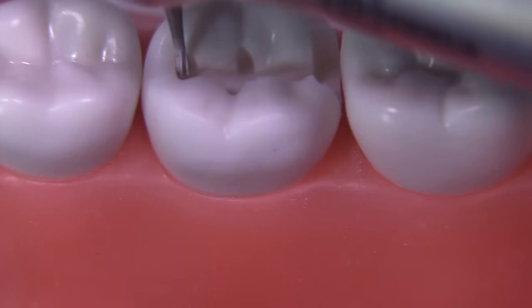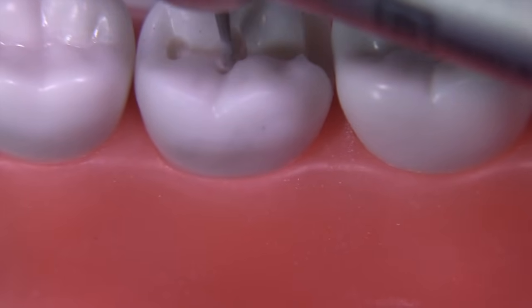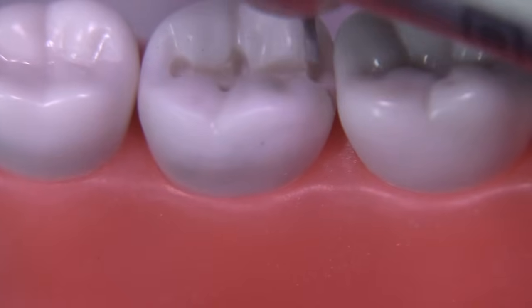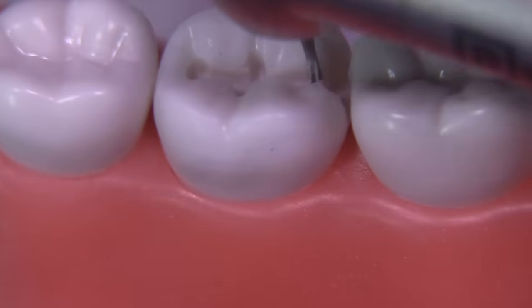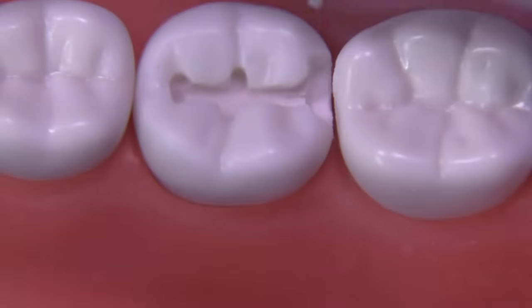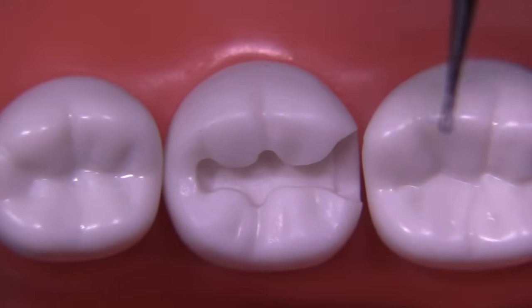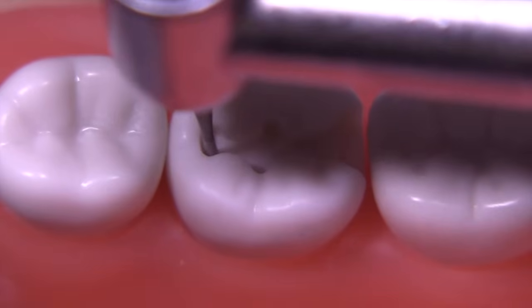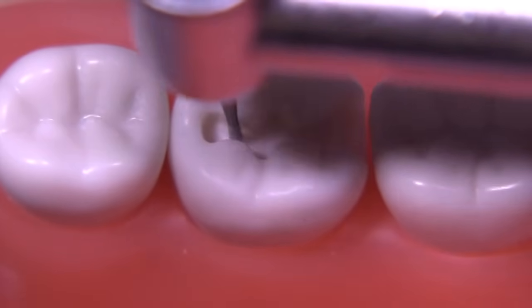When the 330 RGS sticks up above the preparation, you can see your depth is not too deep. It's great for rounding off edges and creating the S-curve even without deepening the pulpal — which is amazing, because most of the time using a regular 330 you end up going deeper pulpally and creating a little dip in the pulpal wall. This burr doesn't do that. Why not use a 55 burr? The 55 burr is too sharp on the end — it creates very sharp internal line angles, which are not favorable for amalgams or composites. Also, it's not convergent, so you lose convergency or end up tipping the pulpal wall at an angle trying to clean up internal forms.